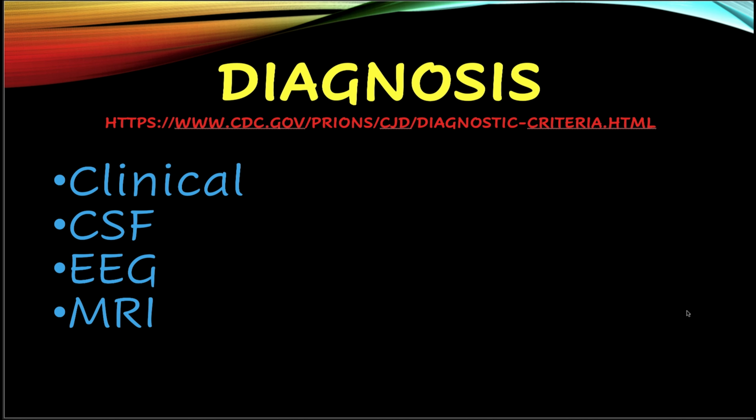I also strongly recommend that you go to the CDC website that is shown here and look at the diagnostic criteria for a definite, probable, and possible CJD.